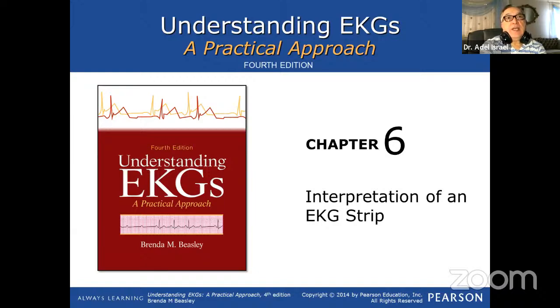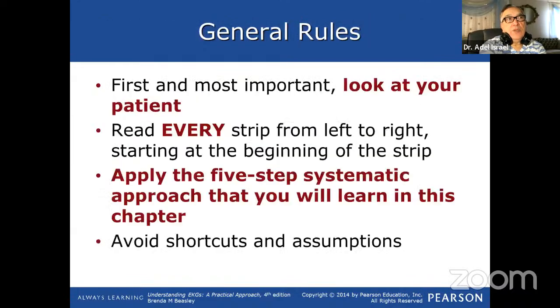We mentioned that we have standard leads, which are lead 1, lead 2, lead 3. After that, we have the augmented leads, which are AVR, AVL, AVF. And then we have the precordial leads, which are V1 to V6. We practiced in the lab how we place the electrodes, and I think most of you already watched the video of how to place the electrodes on one of your classmates. Let us see what we should know for today.